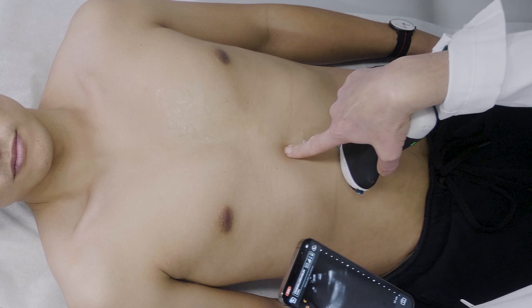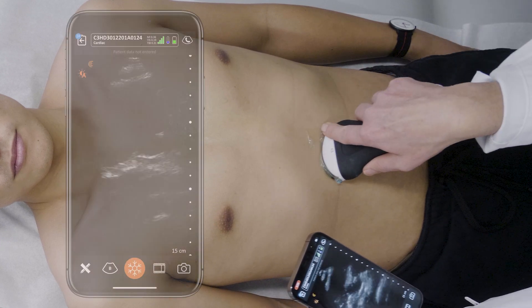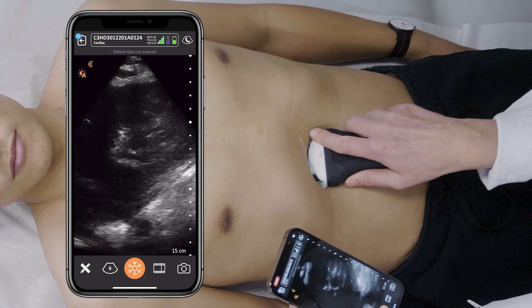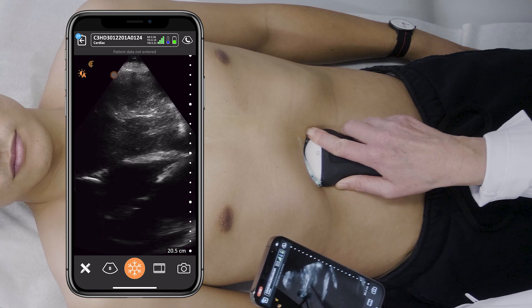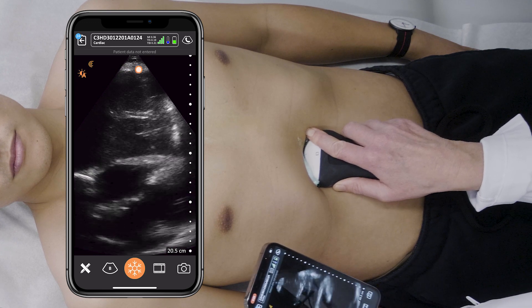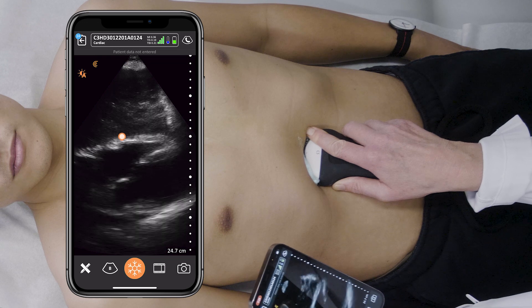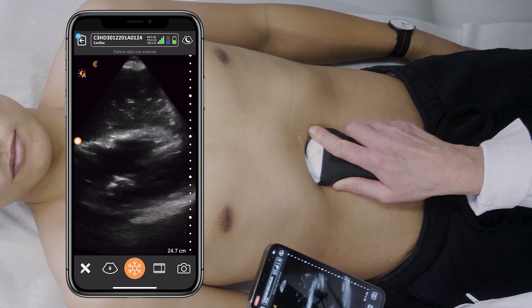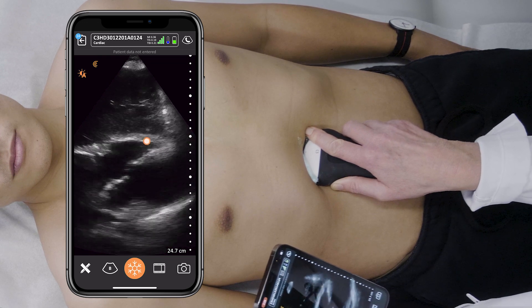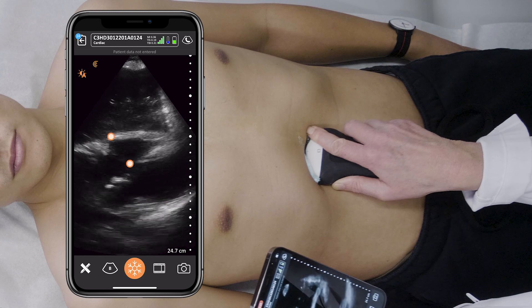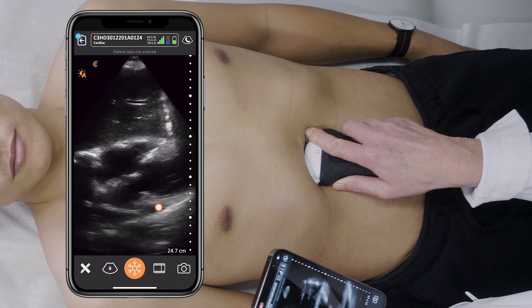Using the xiphoid process as my external landmark, I'm going to look through the liver to get a sub-xiphoid view of the heart. Here you can see the right ventricle, the inferior pericardium, the left ventricle, and both atria.